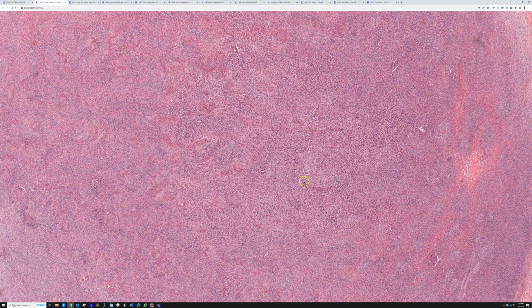And so when you recognize that pattern, you can do an immunostain to help prove the diagnosis. And if any of you are thinking of it, you can say it to your neighbor right now and get a bonus point from me. The answer is MUC4, M-U-C-4. MUC4 is the stain that is positive in low-grade fibromyxoid sarcoma. And it's also positive in this entity here, which is called sclerosing epithelioid fibrosarcoma.